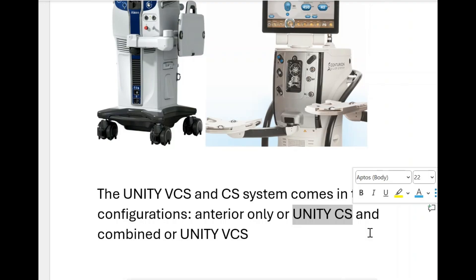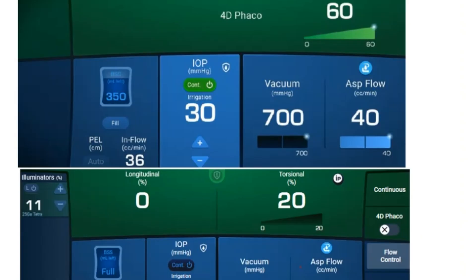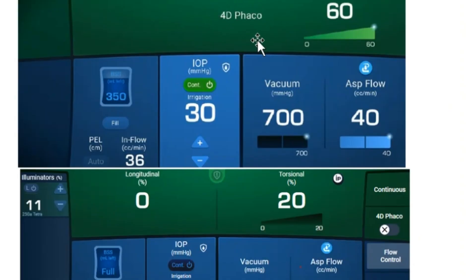The first thing I notice is 4D FECO, as you can see in this panel. The top consultants of Alcon talk about 4D FECO, and I'm curious to understand what it means, because this was not present in the Centurion Vision System. Let's try to understand what 4D FECO means.